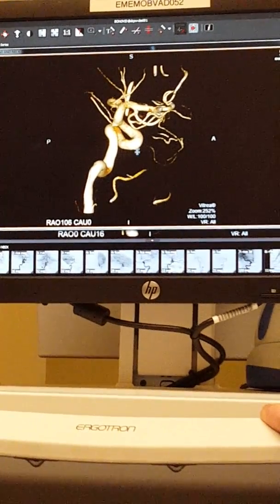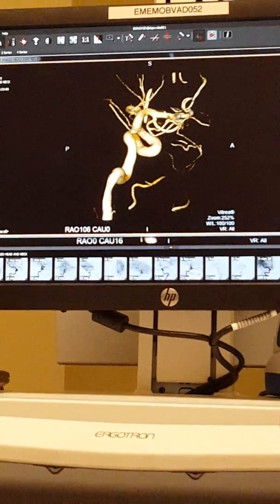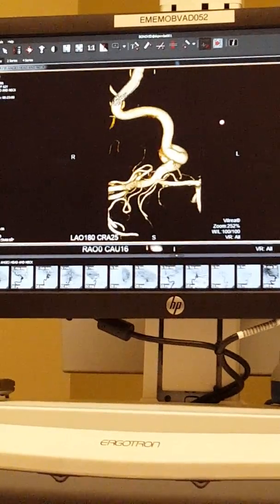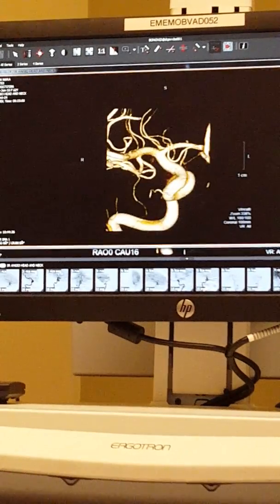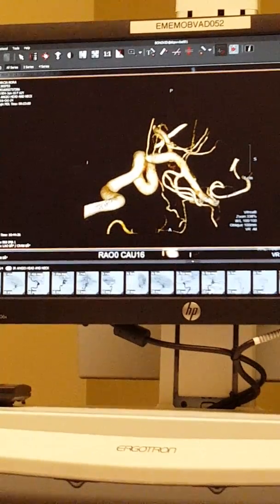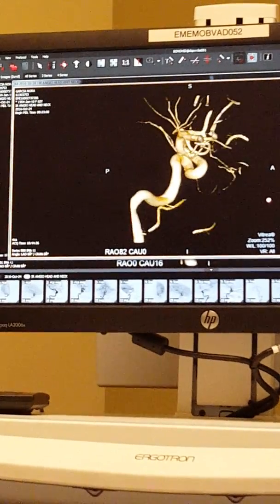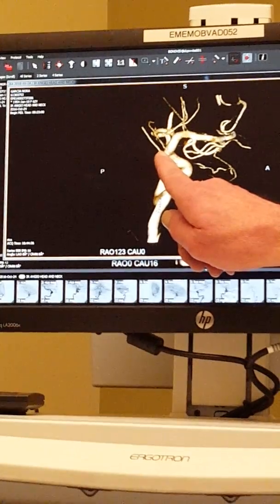The only thing we saw is going to be this area right here. Look real close. It might show up better. The darkened area? No, it's the lighter area. Okay. So it's going to show up best here. This area right here, see the blood vessel?